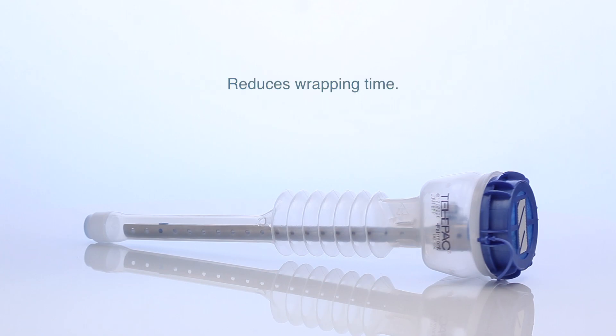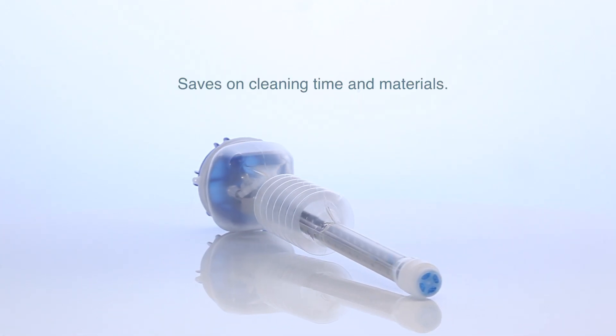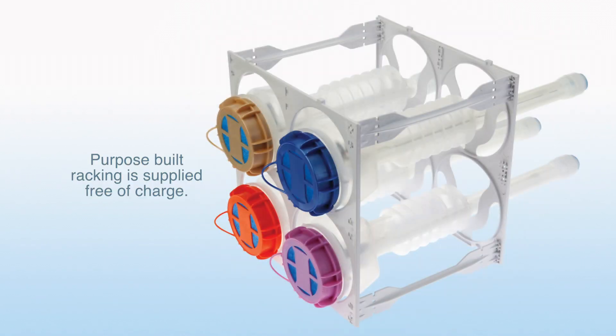Reduces wrapping time. Reduces sterilising cycle costs. Reduces the risk of telescope damage. Saves on cleaning time and materials. Easy identification. Purpose-built racking is supplied free of charge.